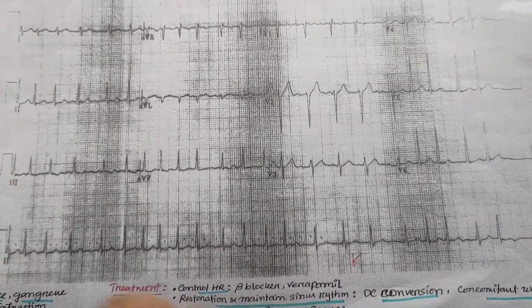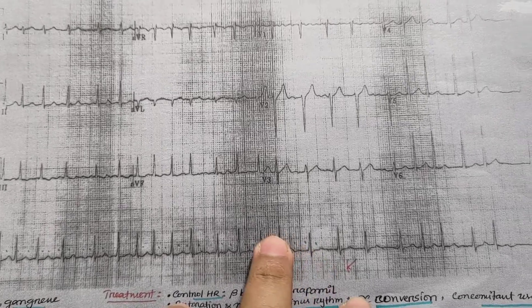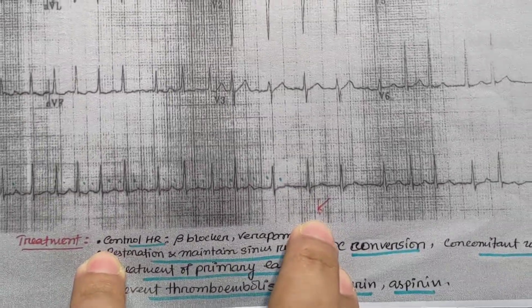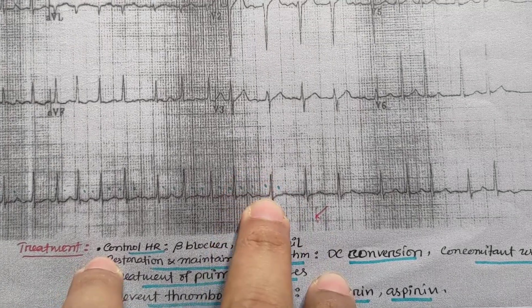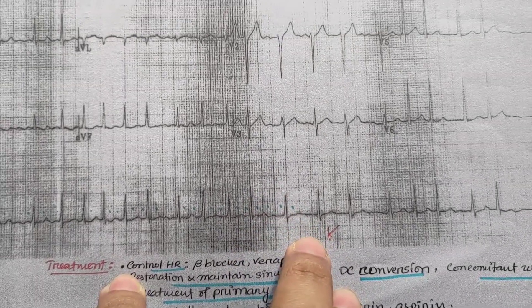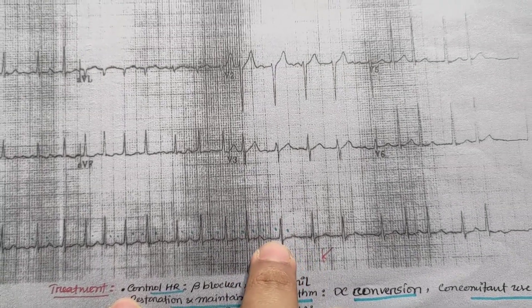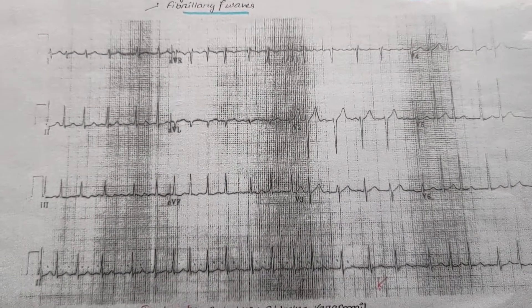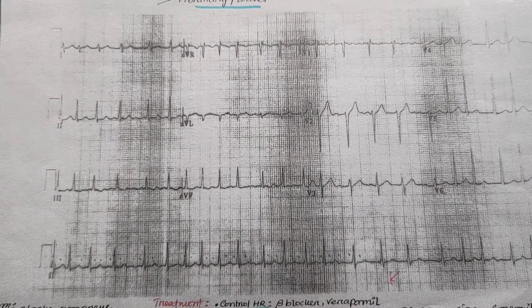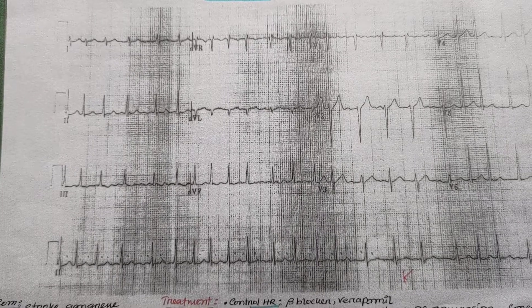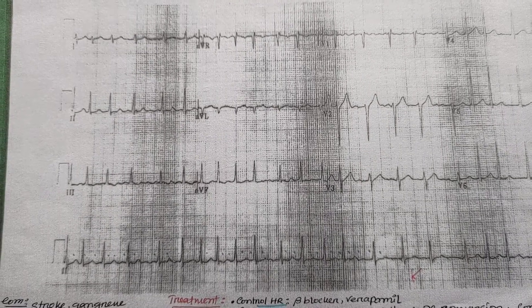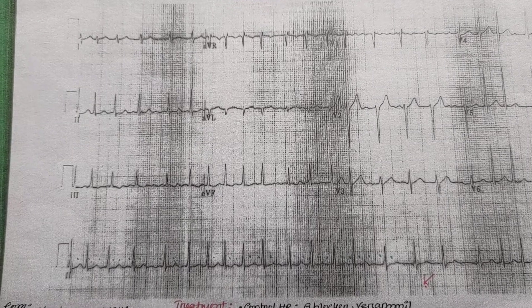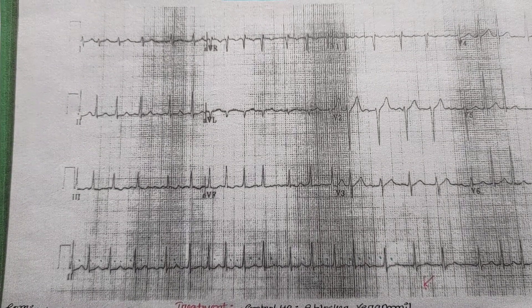F wave — what do you see here? This is F wave. This is F wave. Pathological F wave. Fibrillatory F wave. There is RR interval irregularly irregular, the absence of P wave, and the presence of F wave. So my diagnosis is atrial fibrillation.